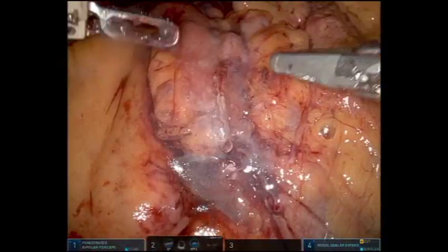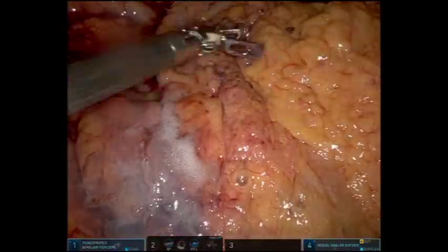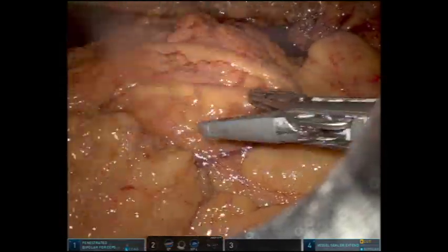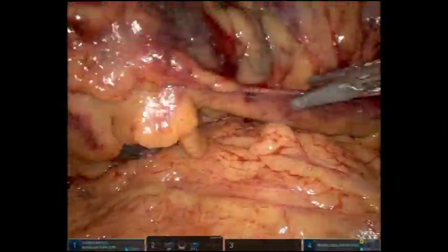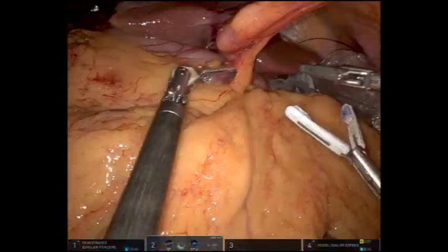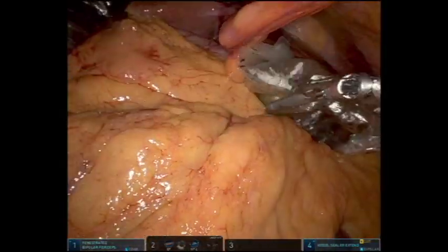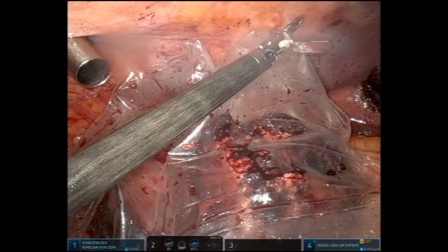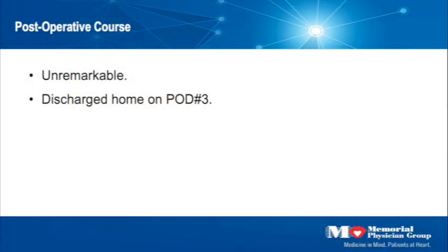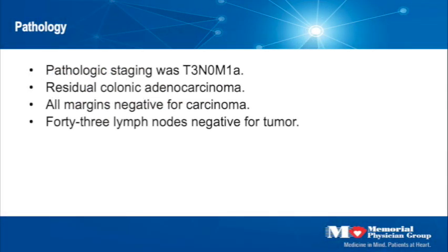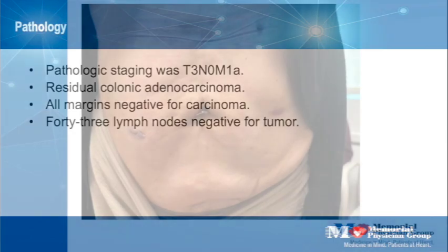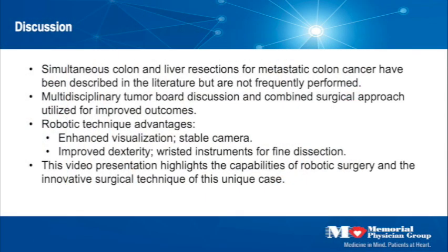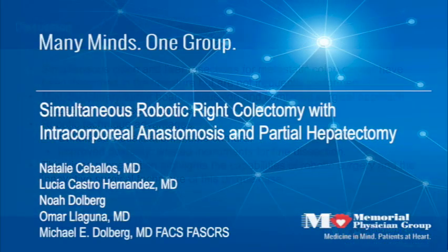The omentum is brought down to cover the anastomosis. The specimen is then brought down to the lower abdomen in preparation for extraction through the Pfannenstiel incision, and the liver specimens are also brought down. She was discharged home on post-operative day three, all margins were negative, and the suprapubic extraction site was well healed at her one-month post-operative visit.